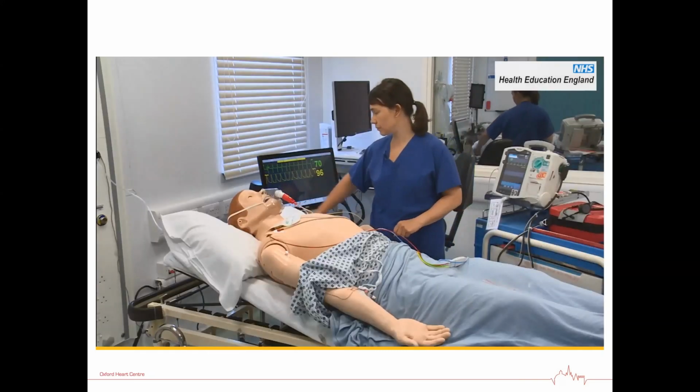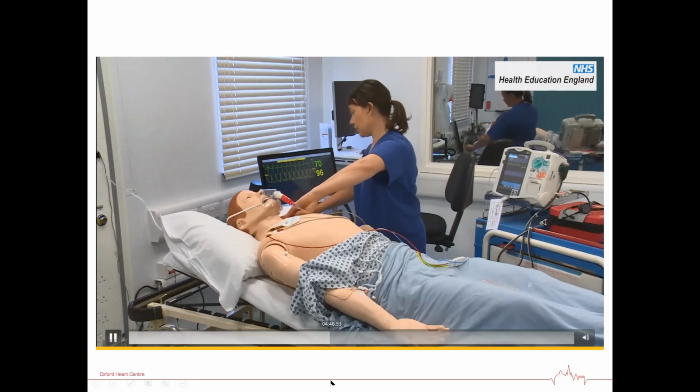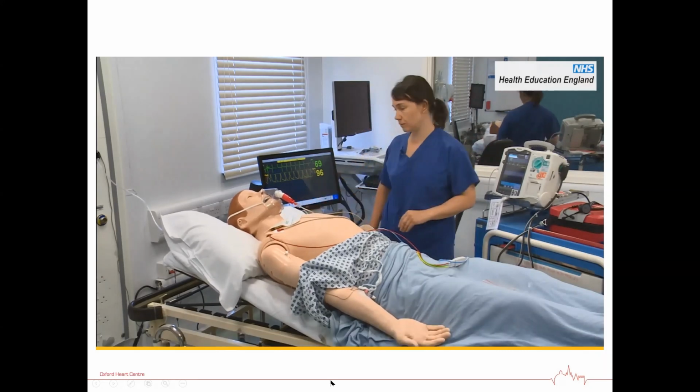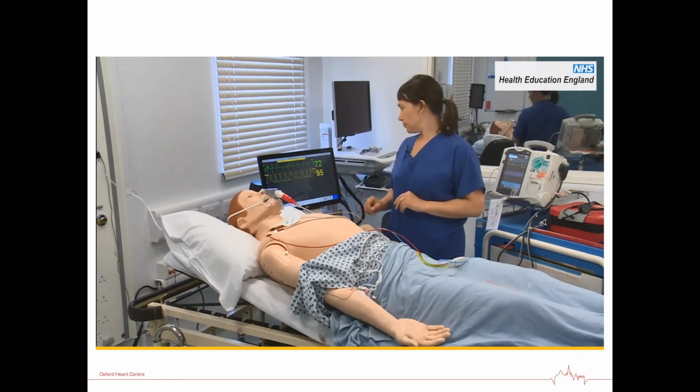Have electrical capture. Can you confirm mechanical capture with the pulse? Yep, I have a pulse. Okay. Let's repeat our ABCD assessment now that we've got an adequate heart rhythm. We're just seeing a couple of ectopics there, I believe. Otherwise, we are having capture.